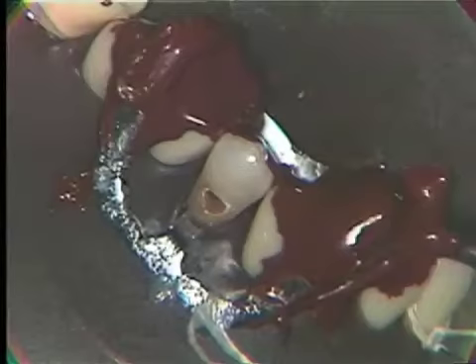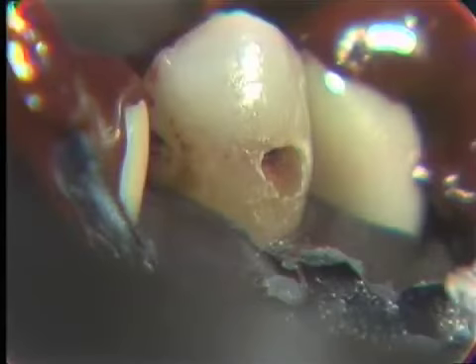The carious area, as noted, is somewhat smaller, and therefore our selection of instruments will be of a smaller dimension. So in this particular case, using a high-speed operation, we are going to penetrate with a number 1 round bur.